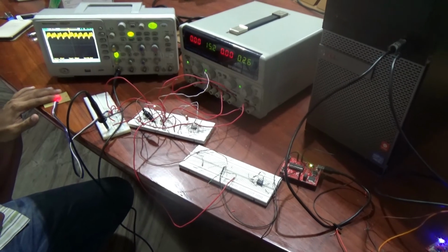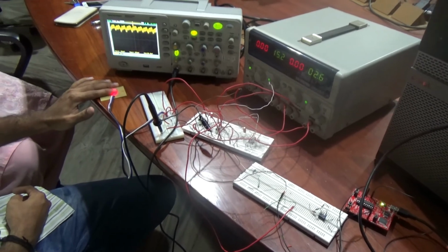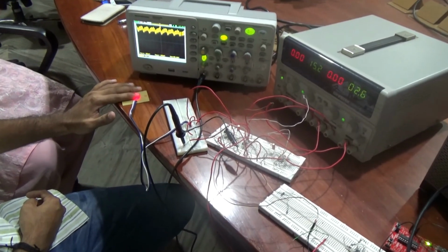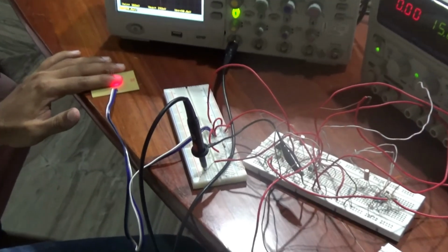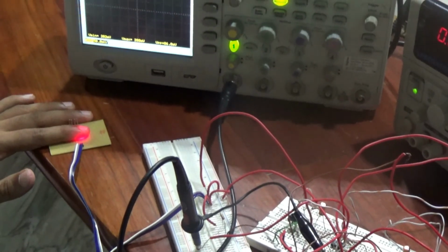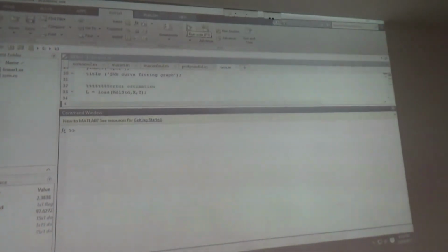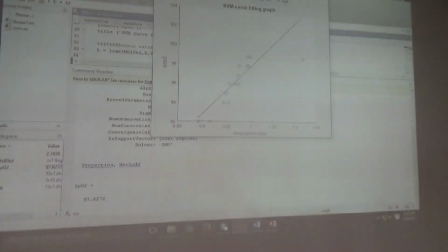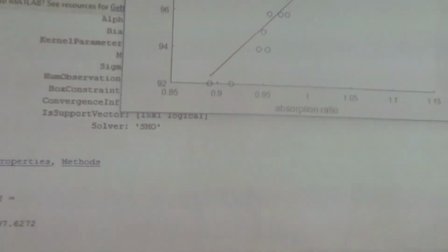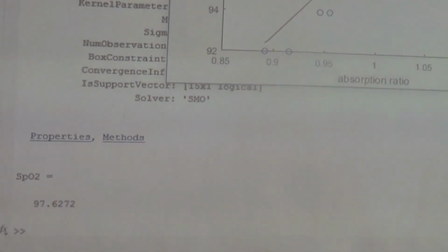For SpO2 measurement, the same amplification and filtering circuit which was described earlier is used along with the sensor DC-M03. From the output PPG, the AC to DC ratio of both red and infrared is taken, from which the SpO2 data is derived. For SpO2 measurement, we are using a support vector machine algorithm. The graph shows the fitting while using SVM and the result is as displayed in the command window with an error of about 1 to 2%.